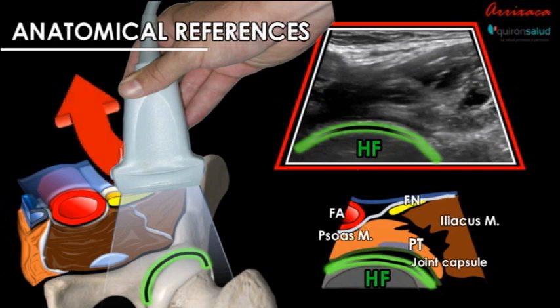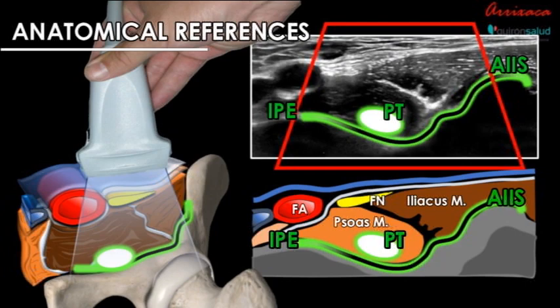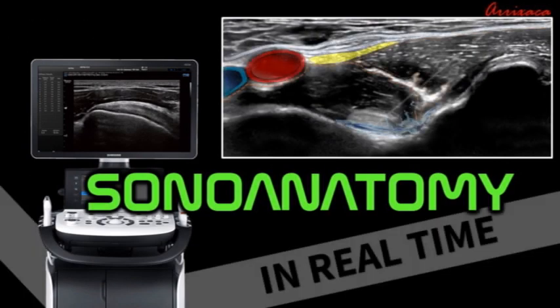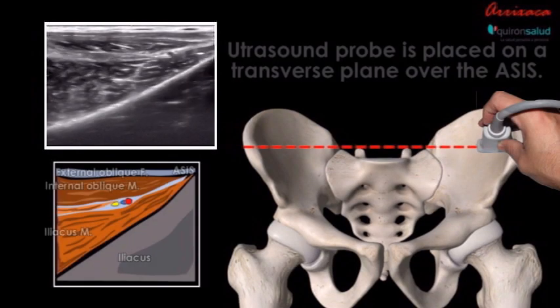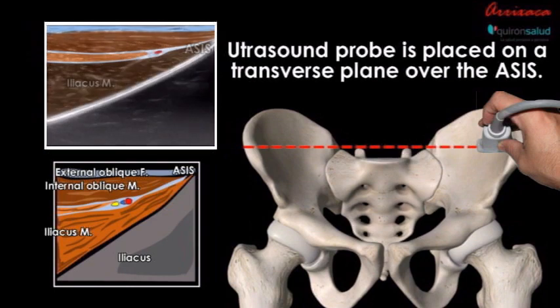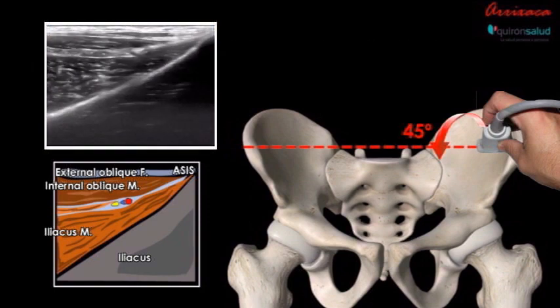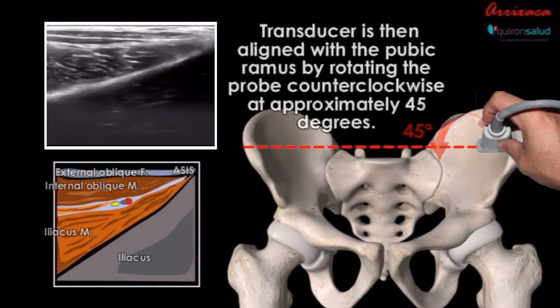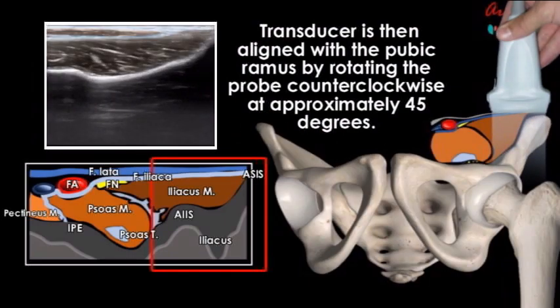At this point we return to our initial position to identify the reference points again. With the ultrasound probe placed over the ASIS transverse line and with the ASIS identified, the transducer is then rotated 45 degrees again, aligning the ASIS, the AIIS, the iliopubic eminence, and the pubic ramus for dynamic viewing.